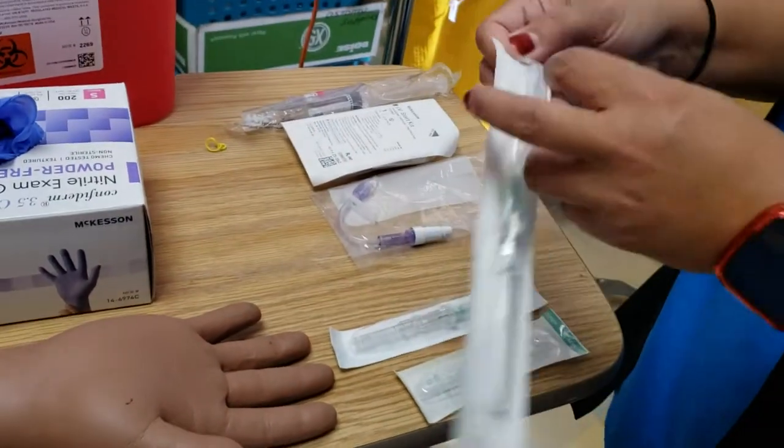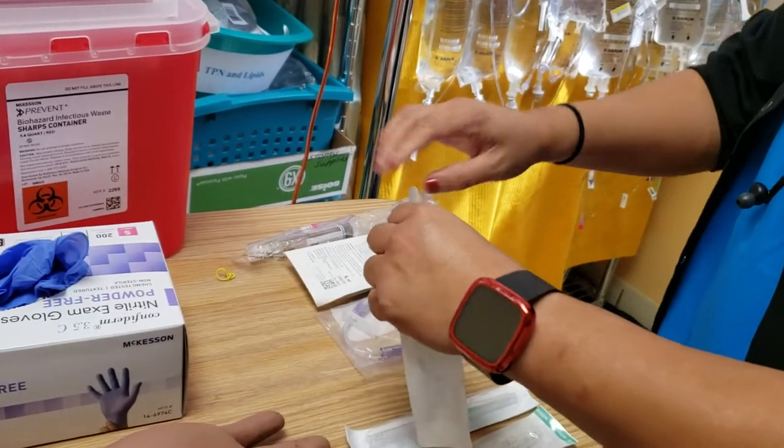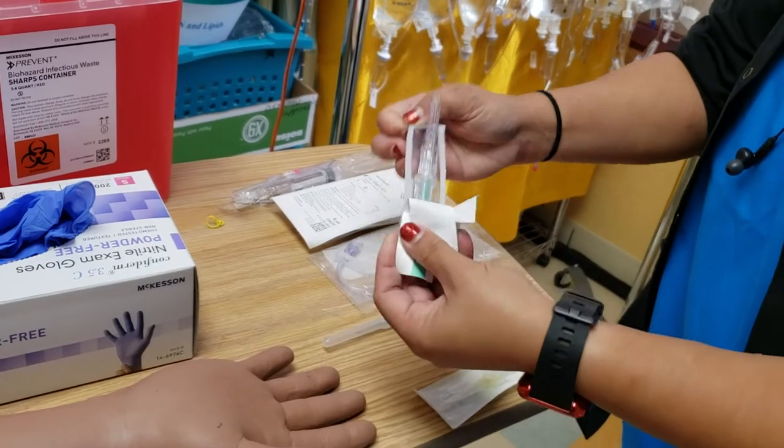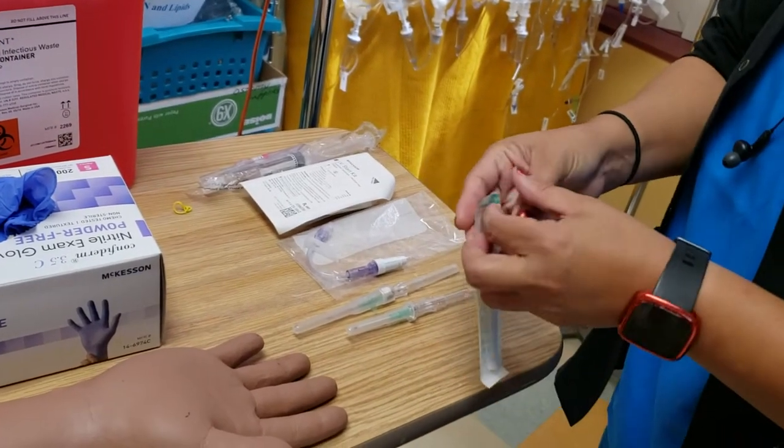So what I do is get all my things ready and open all these packages. I suggest you have a trash can close by so you can get rid of all the trash you don't need, so it's not in your workspace.